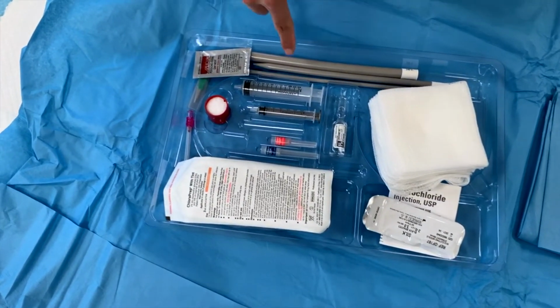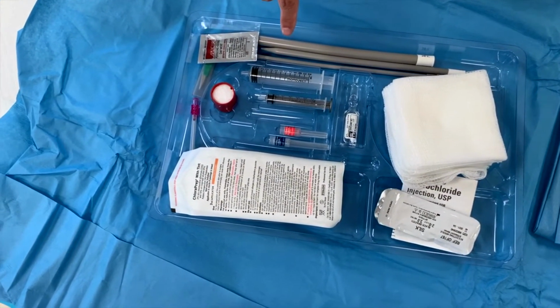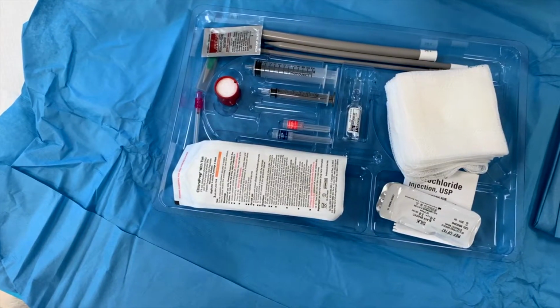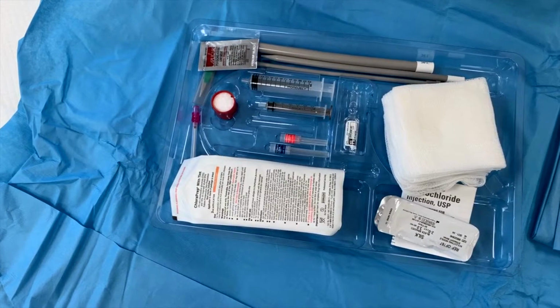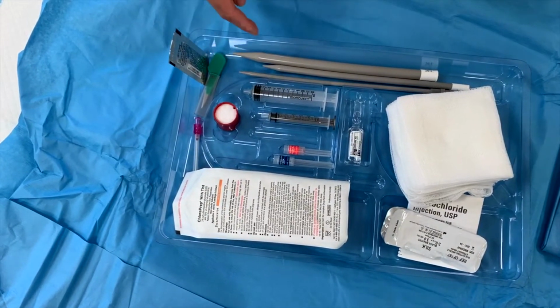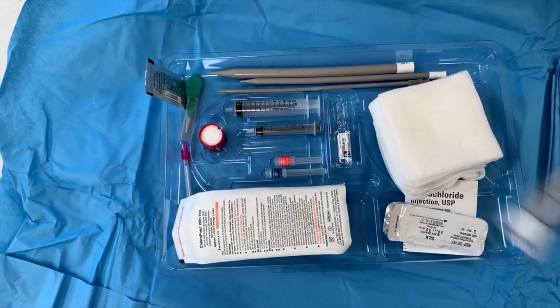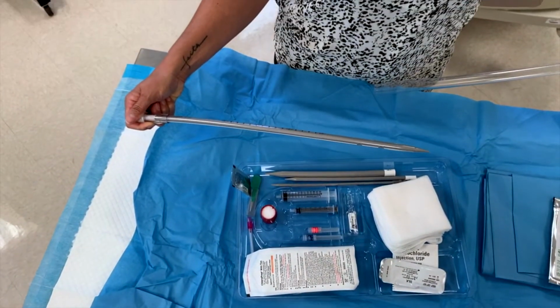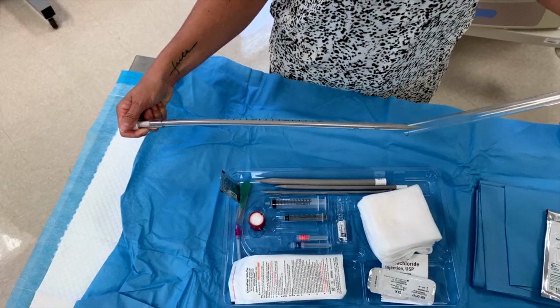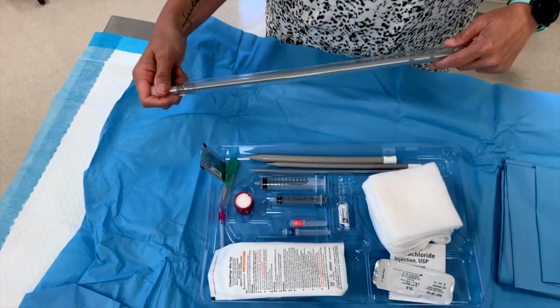These are the stylets they use to help open up that chest cavity. All right, there's different sizes, so we can start small and then get bigger up until we can even get this big, which is even larger than those other two. And that's just to open up that chest cavity so that we can insert the actual chest tube itself.